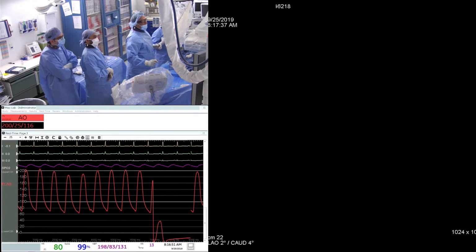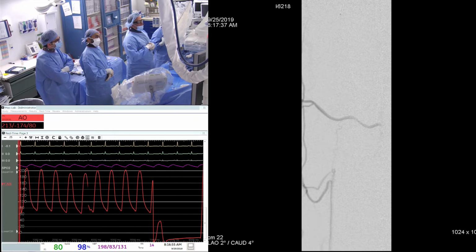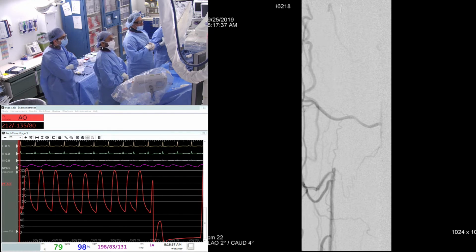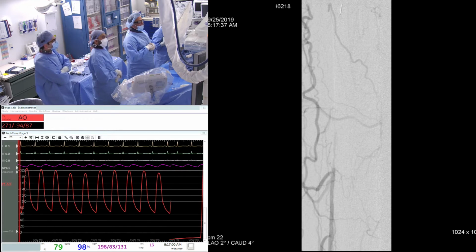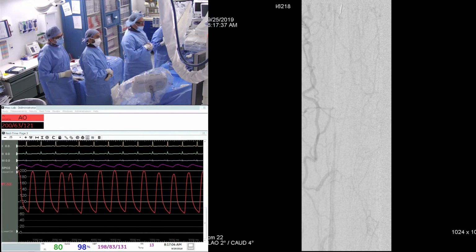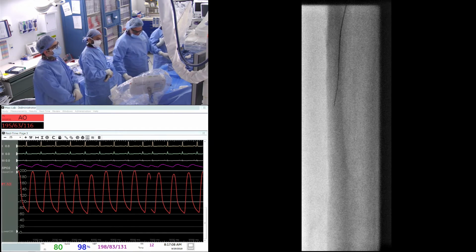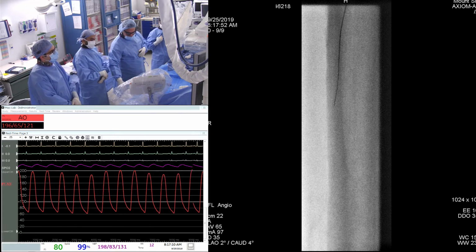I think most interventional cardiologists are using more the 014 wires and not so much the 018 wires. And I think you're right. It's very important for us to really have an understanding of what the options are. So we generally do exactly what you do. We start with an 014 wire like this, and then we're going to do a wire escalation technique.